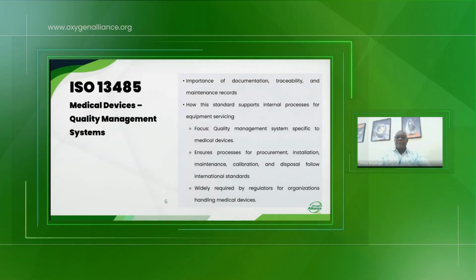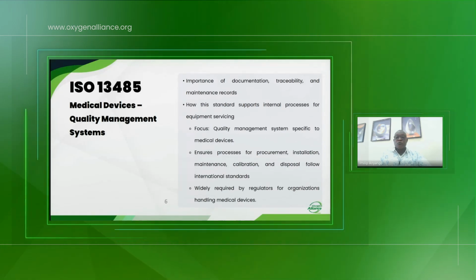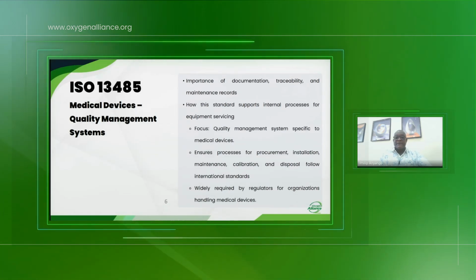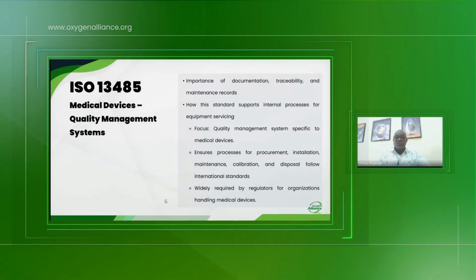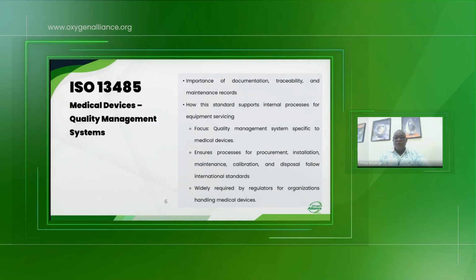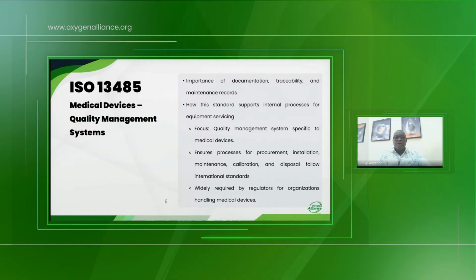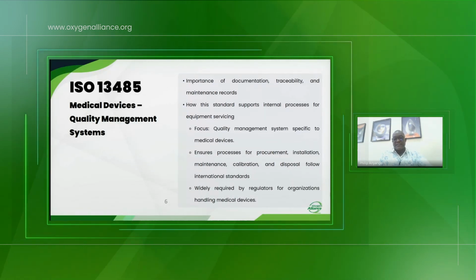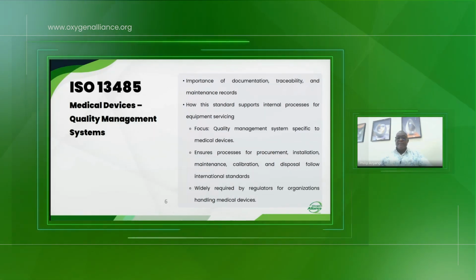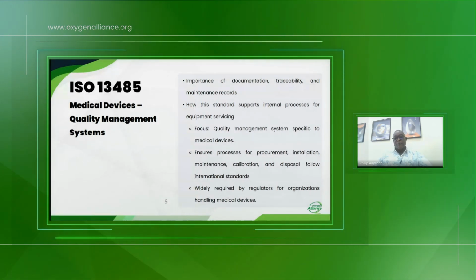How this standard supports internal processes for equipment services. It focuses on quality management systems specific to medical devices, and ensures processes for procurement, installation, maintenance, calibration, and disposal follow international standards. It is widely required by regulators for organizations handling medical equipment.